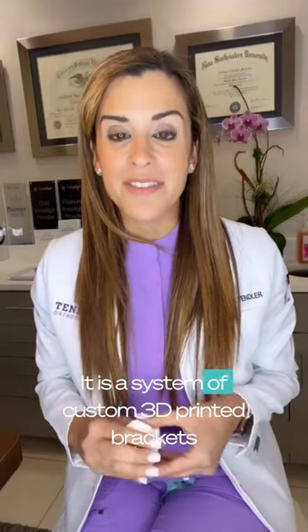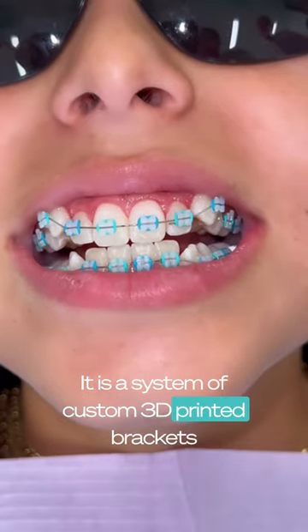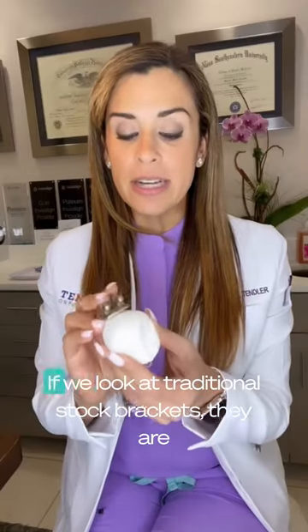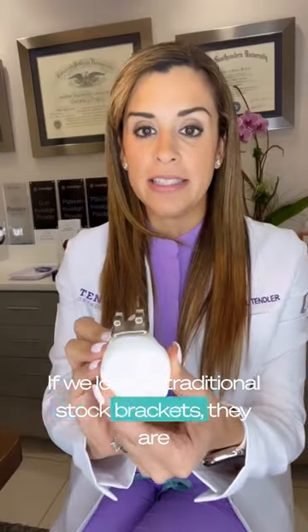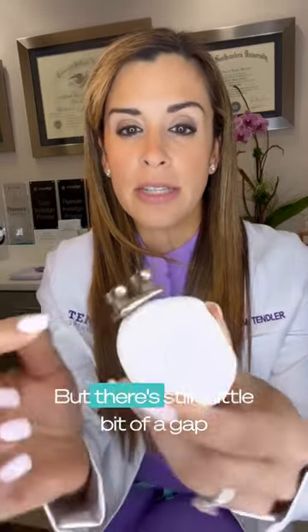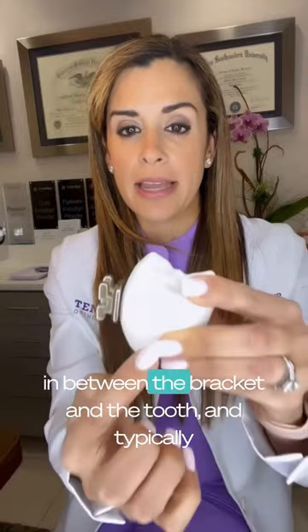LightForce is a system of custom 3D printed brackets that are made to the shape of your teeth. If we look at traditional stock brackets, they are made to fit over your teeth like so, but there's still a little bit of a gap in between the bracket and the tooth, and typically we have to fill that in with glue.